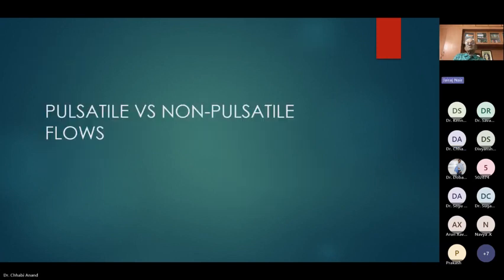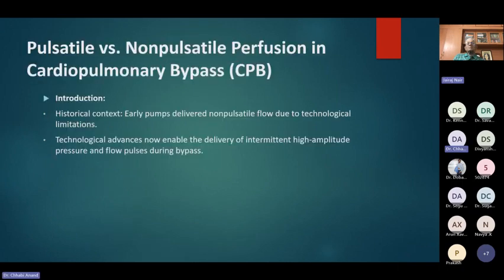Pulsatile versus non-pulsatile flows. Historical context: early pumps delivered non-pulsatile flow due to technological limitation. Technological advances now enable the delivery of intermittent high-amplitude pressure and flow pulses during bypass.